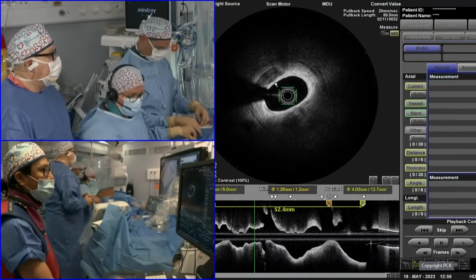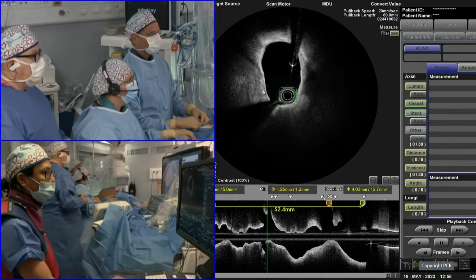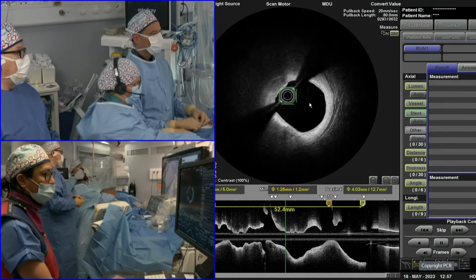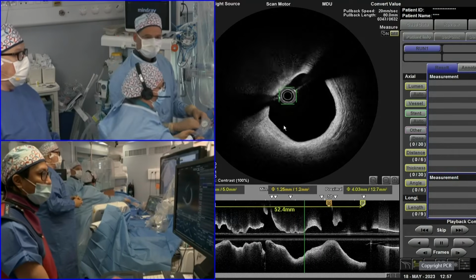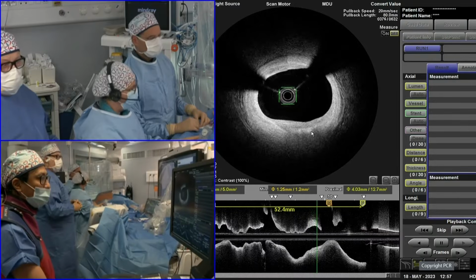And you can see that there is some calcified plaque, which is usually on both sides of the vessel, just around the diagonal. You see this wire of the diagonal is coming now into the LAD. There is a relatively preserved lumen with 3 mm in diameter, and there was also fibrotic plaque in this proximal region.